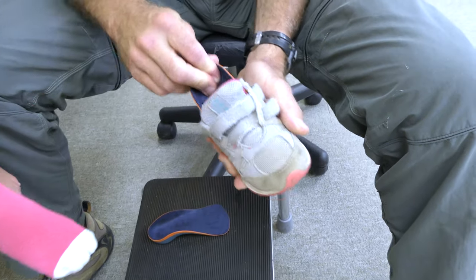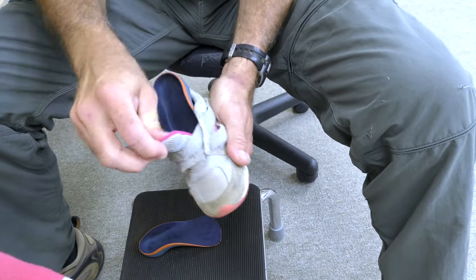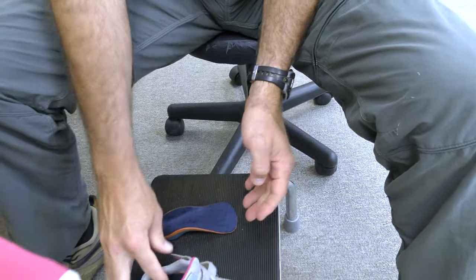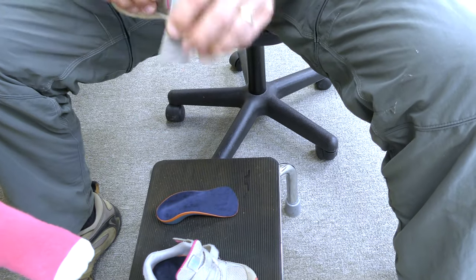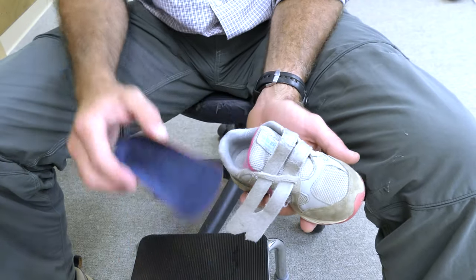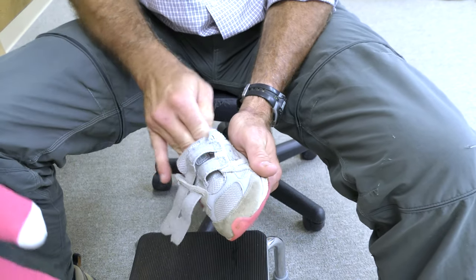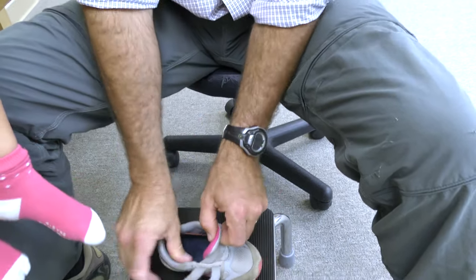Next, fit the orthotic into the shoe. Traditionally, shoe liners are to be removed before the orthotic is inserted, but if the liner is thin and flat, it can be left in. If unsure, try it both ways and see what works best. The orthotic should be placed back into the heel of the shoe.